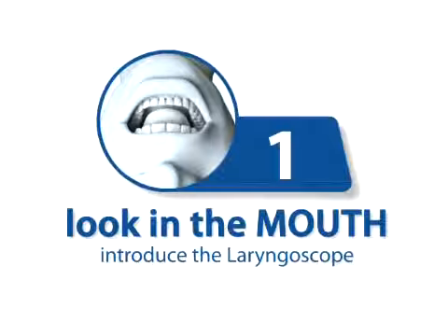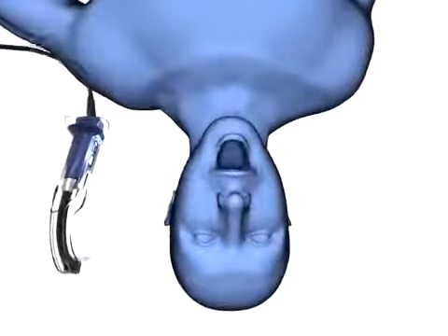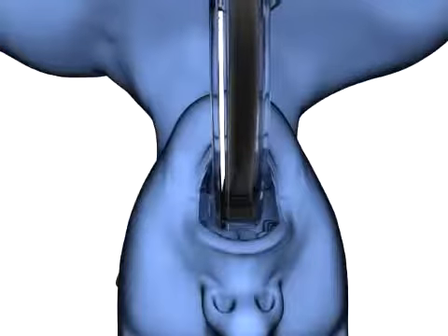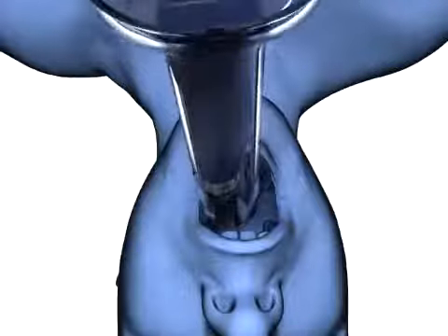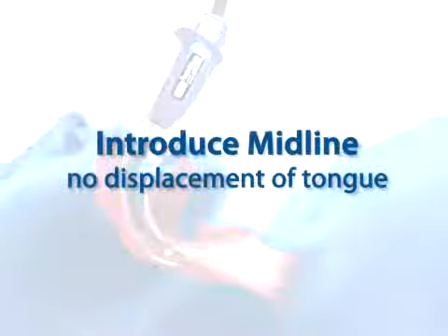Begin step 1 with direct vision, looking directly into the patient's mouth. With the patient appropriately positioned and with the GlideScope video laryngoscope in your left hand, introduce the GlideScope into the midline of the oral pharynx. Gently advance the GlideScope until the tip of the laryngoscope is past the posterior portion of the tongue. Unlike conventional laryngoscopy, the GlideScope video laryngoscope is introduced midline. No lateral displacement of the tongue is required.